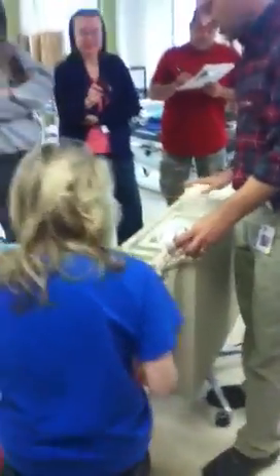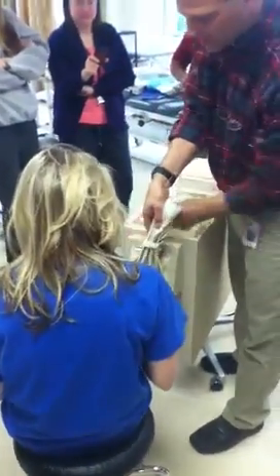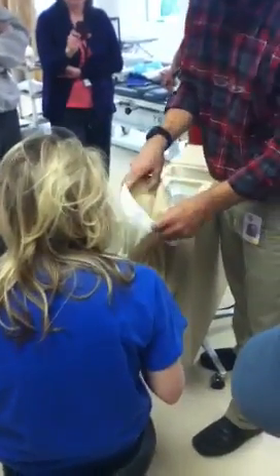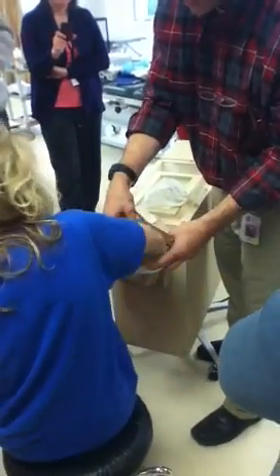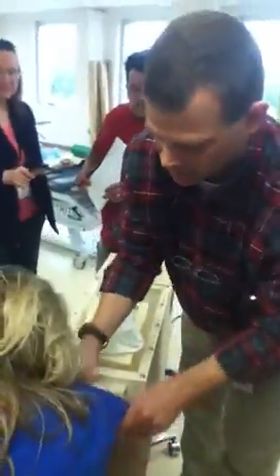The key to this thing: you don't want to make a big mess. So this thing needs to be always Velcroed when it's not in use to keep things out of it. We've got our little sleeve and we're going to stick your hand way up in there, and then I'm going to Velcro it so it doesn't get crazy. Now we'll see if we can get it to run here.